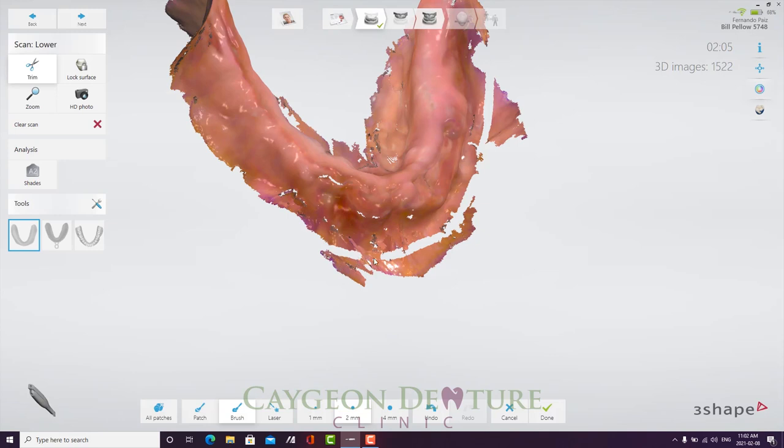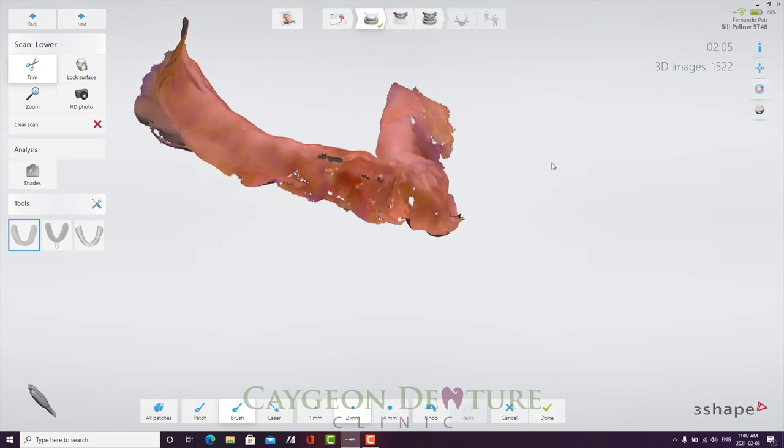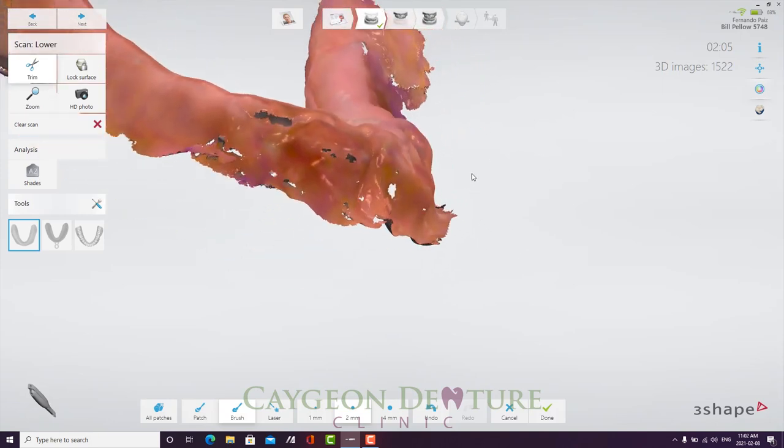As you can see, I'm still not an expert at scanning edentulous mouths, but it is extremely exciting for me to be able to fabricate a denture from this scan.